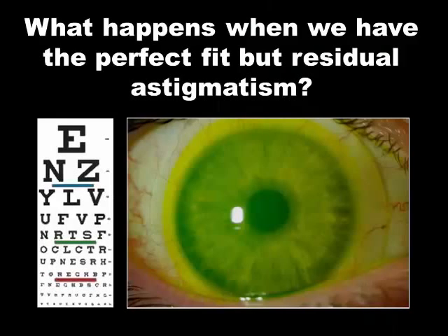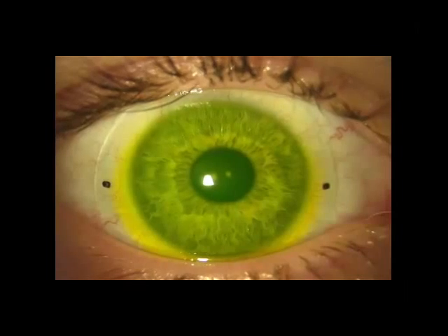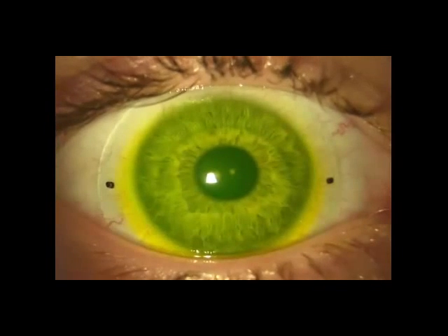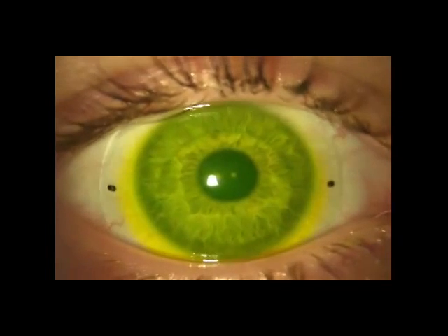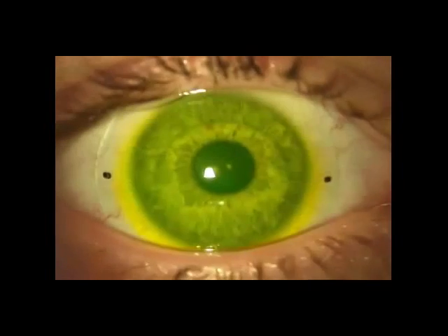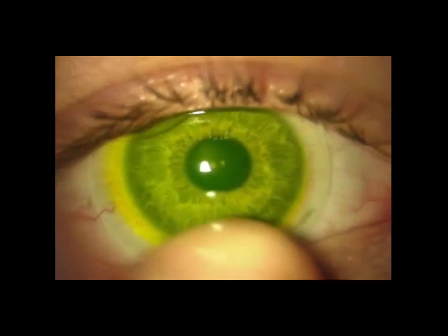So when you place a standard ICD on a patient, and it does align 360 degrees around, you don't need a toric, but if you have any kind of residual astigmatism, then what do you do? This is where the ICD toric is beneficial. I hope this video will come through the internet, but what you see is an ICD toric on eye with its scribe marks at 3 and 9 o'clock, 0 and 180.